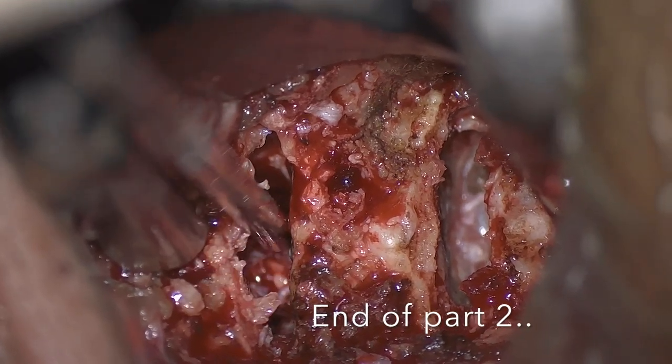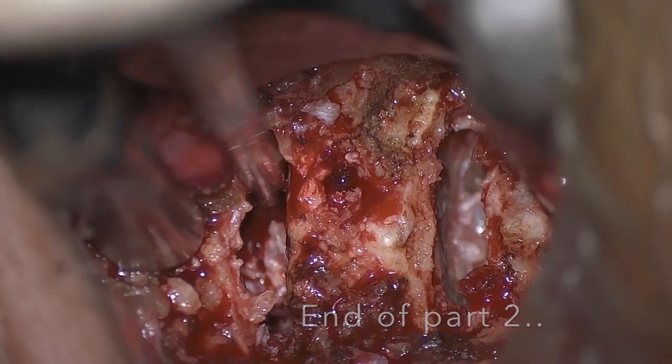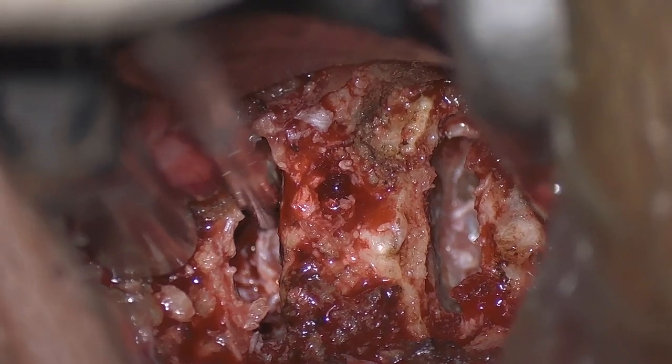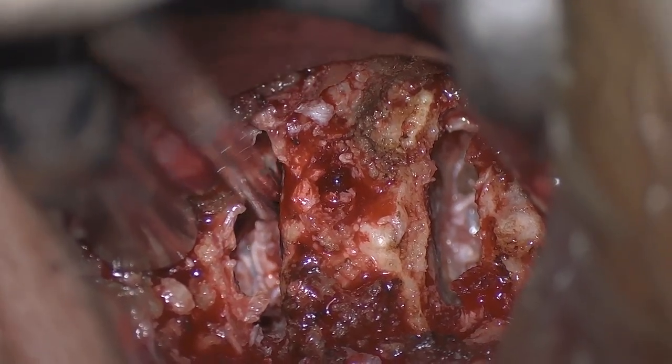This is the end of Part 2. In Part 3, we will see how to perform a corpectomy.